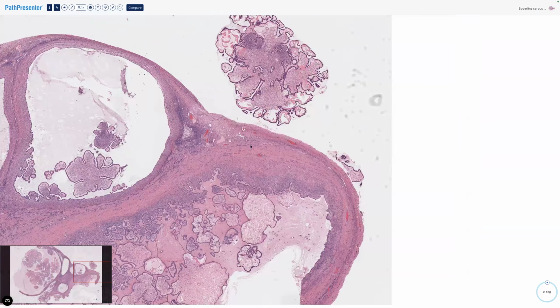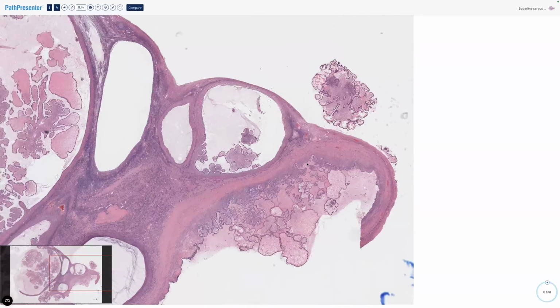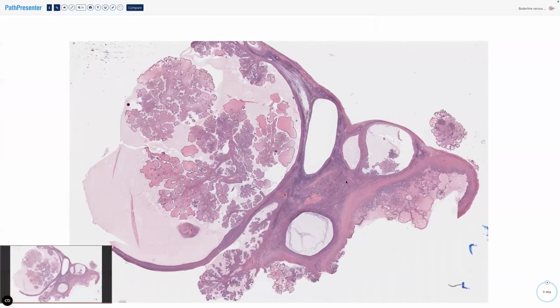And to actually determine whether they're on the outside, we have to see them attached. So when it spreads around the abdomen in serous borderline tumor, we call these implants. We can't call them metastases because it's not actually cancer. It's a precancer, so we call them implants.